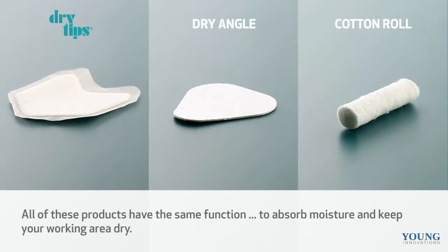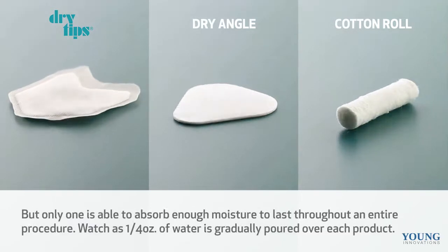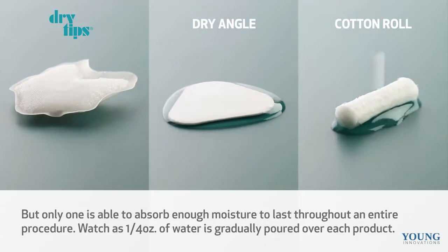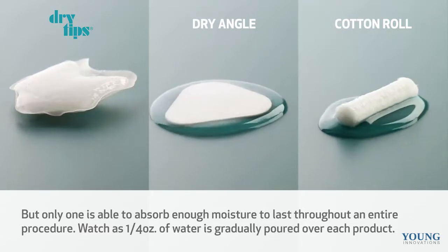All three of these products have the same function: to absorb moisture and keep your working area dry. But only one is able to absorb enough moisture to last throughout an entire procedure. Watch as the same amount of water is gradually poured over each product.